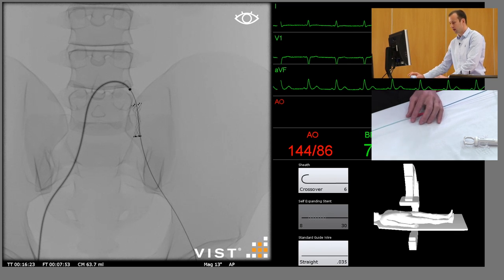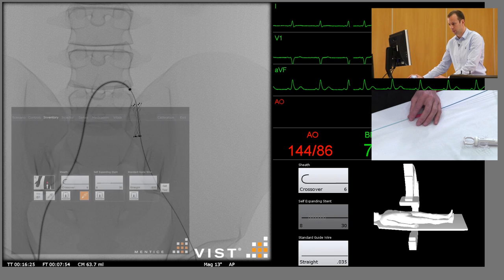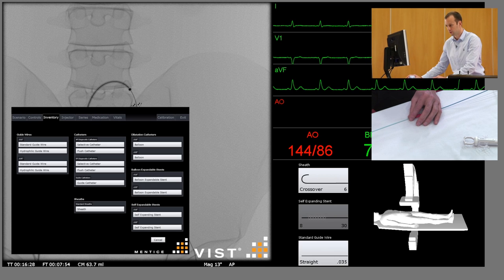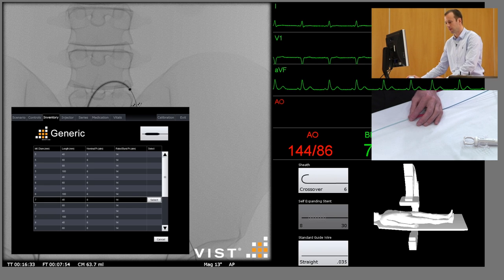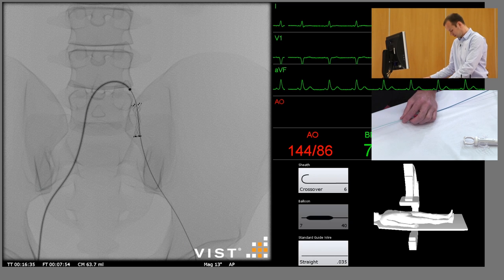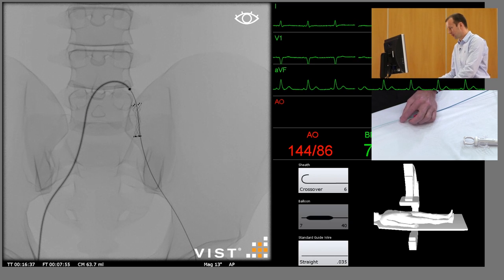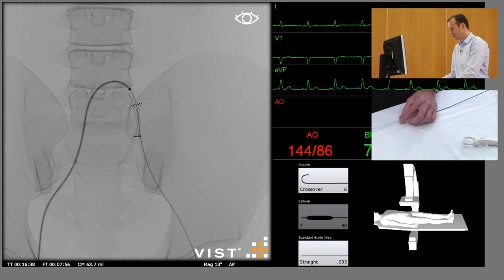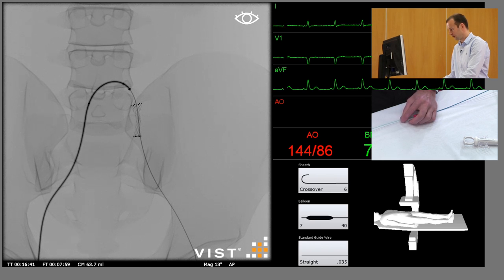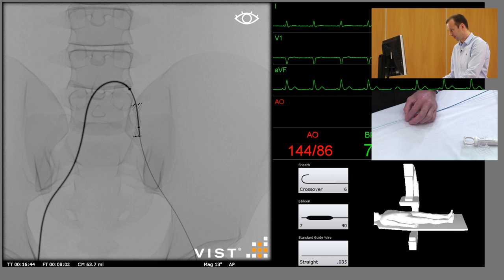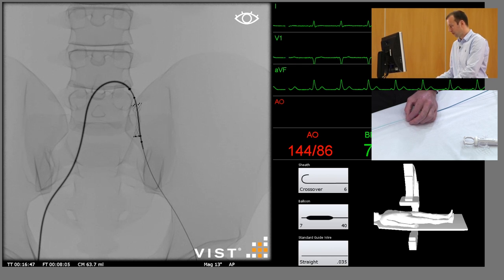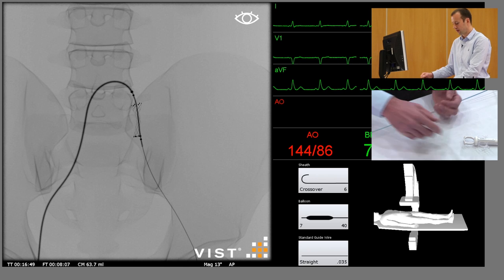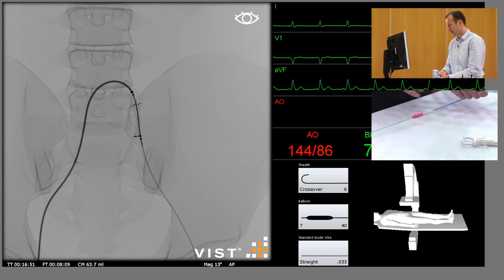So we remove the stent delivery system and we'll insert a balloon. The correct size is a 7mm balloon. Generally we use 1mm smaller than the stent size, or the stent is sized 1mm greater than the vessel size. Insert the balloon across the lesion.